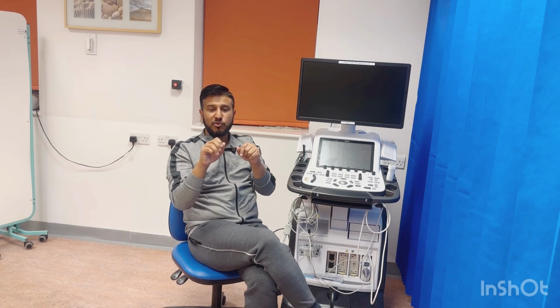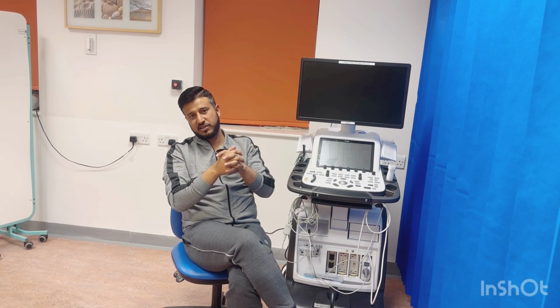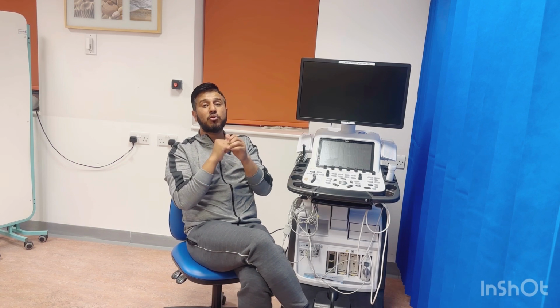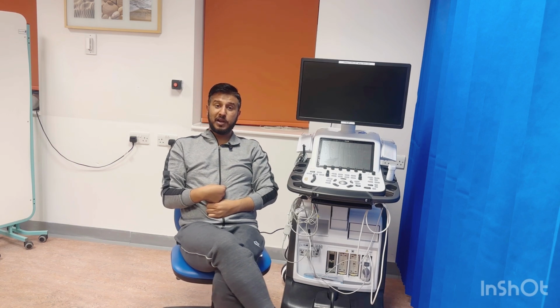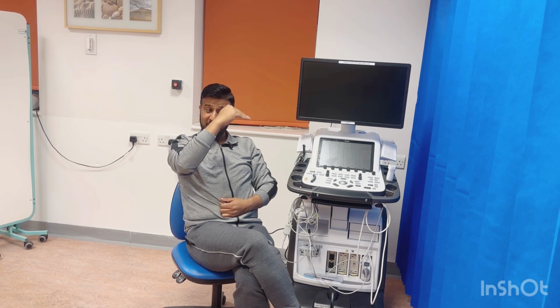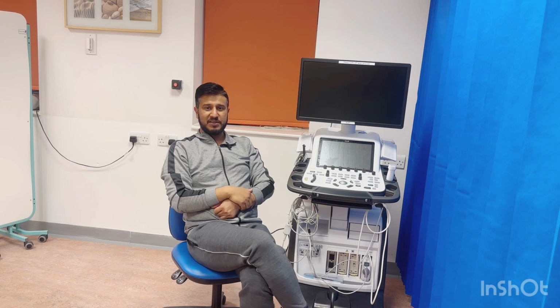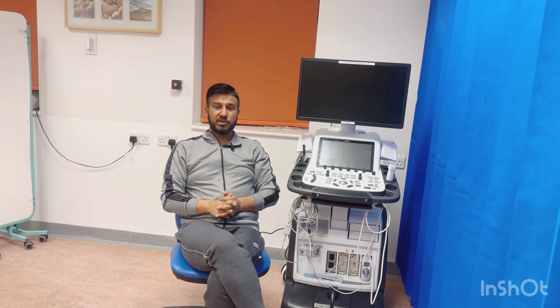Sometimes what we do is we put the Doppler there, we do everything right, but our scale is very high, so we don't see any reversal there. Always keep an eye that you need to decrease your scale to look at the reversal. And then you can do the same thing in the abdominal aorta. In the abdominal aorta, your flow reversal will be below the baseline, and the systolic flow will be above the baseline. Okay. So these are the different parameters to assess aortic regurgitation.